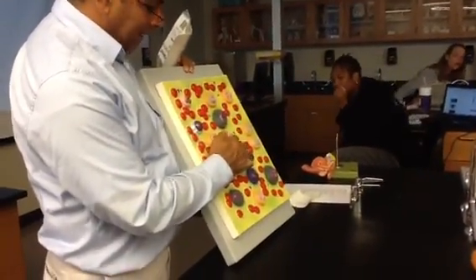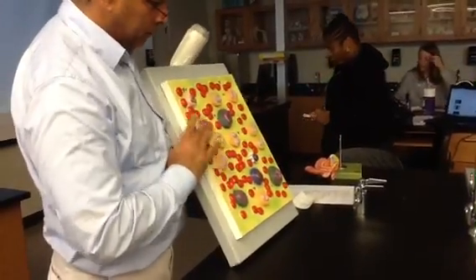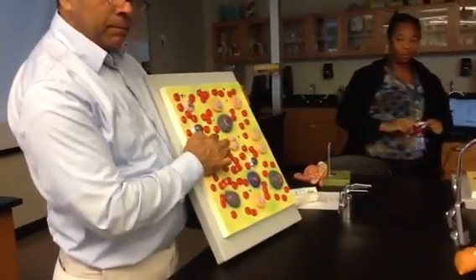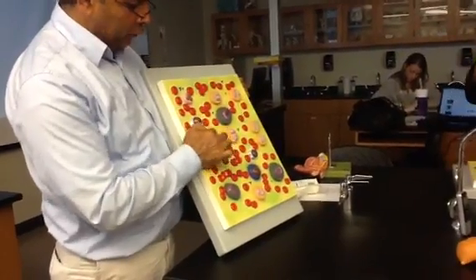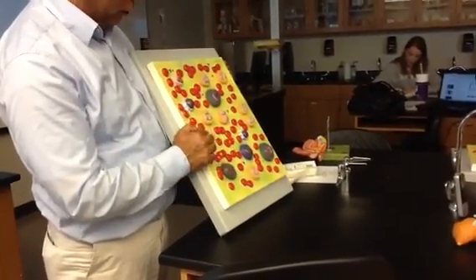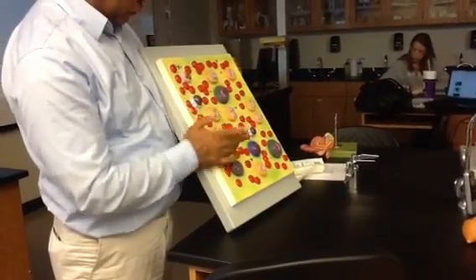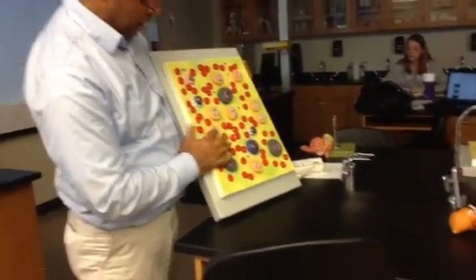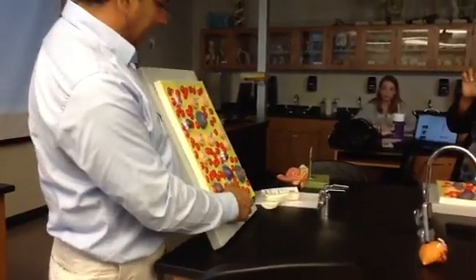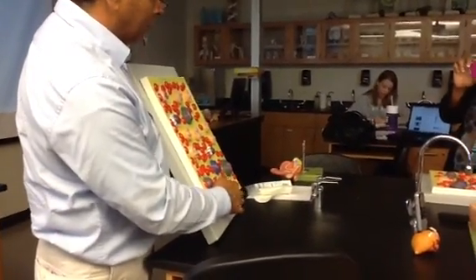If this cell does not have orange-red granules, and you're just witnessing the lobes here, then this is a neutrophil. And you know a normal neutrophil has between 2 to 5 lobes. So this would be a neutrophil, this would be a neutrophil, but this is an eosinophil. Why? Because it has orange-red granules.